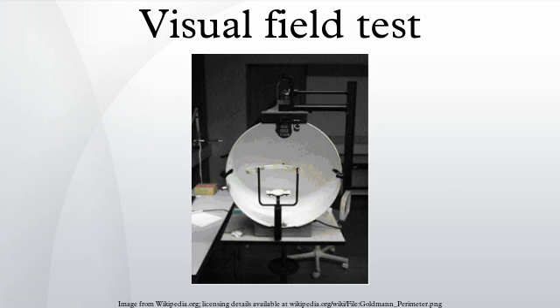Types of perimetry. Tangent screen. The simplest form of perimetry uses a black tangent screen. Vision is tested by presenting different-sized pins attached to a black wand, which may be moved, against a black background. This test stimulus may be white or colored. Goldmann perimeter. The Goldmann perimeter is a hollow white spherical bowl positioned a set distance in front of the patient.